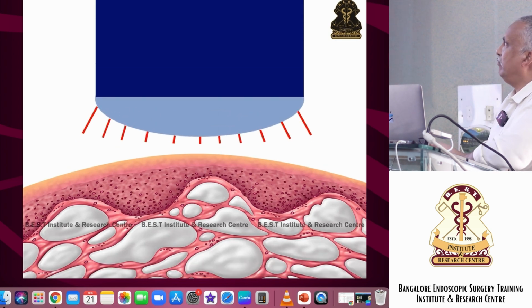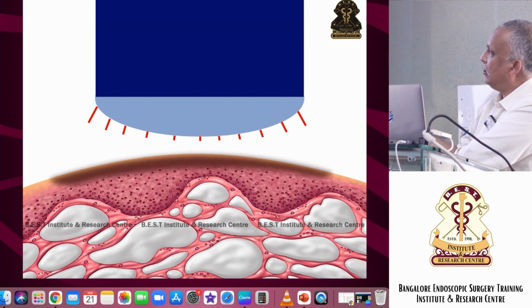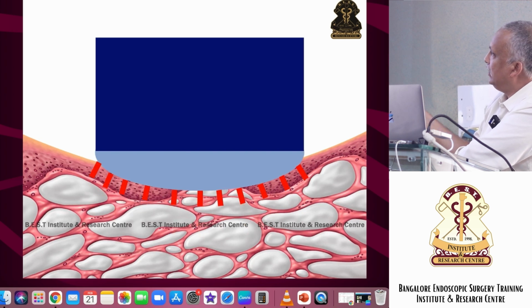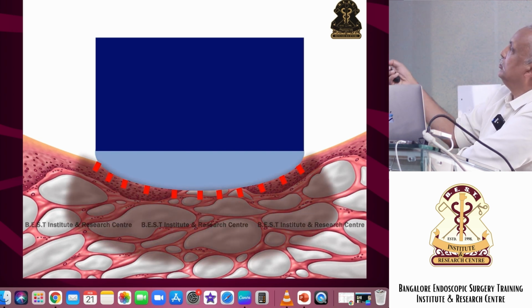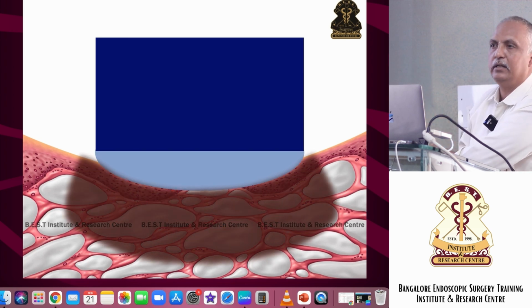So this is a wide electrode. You bring it very close, and as I said, it is non-contact. It's not coming in contact. So that will only coagulate the surface for fulguration. But the same thing, you press on the tissue, you have deeper coagulation. A big area is coagulated.